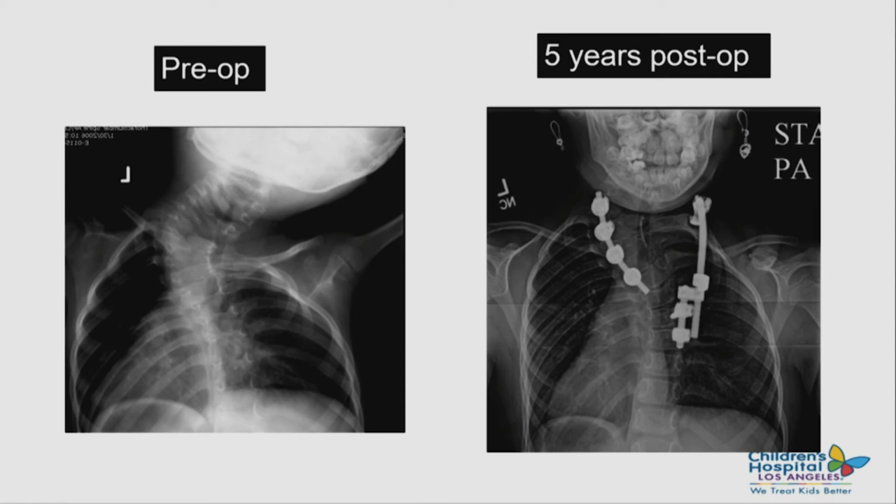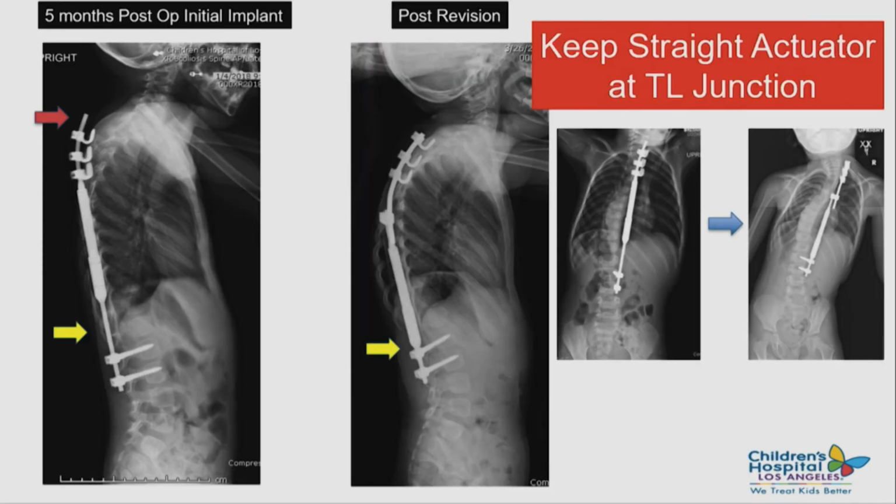So 2 questions. Number 1 is going back on revisions of these, in the ribs, you pull through and you get a large bar between 2 ribs that you want to use again. First of all, how do you tackle that question when you have several of them fused? Second of all, there's a lot of people who argue that putting rib hooks on there changes the chest function. It stiffens the chest. How do you?